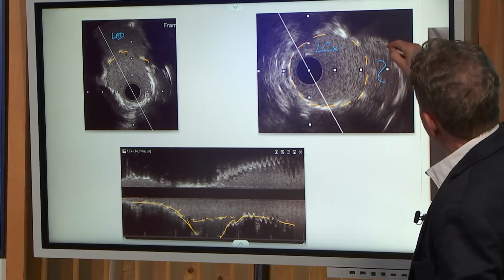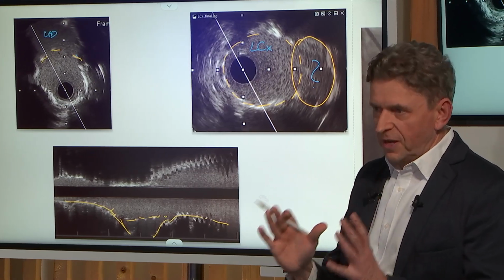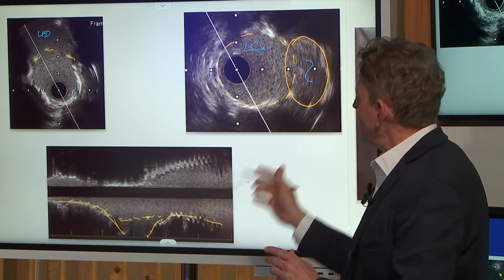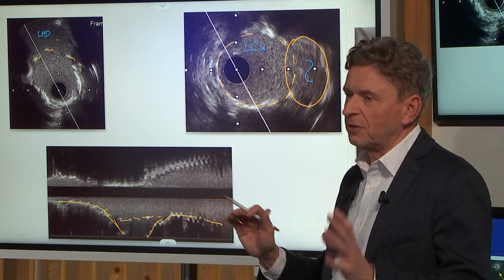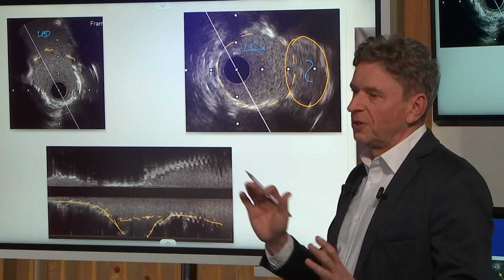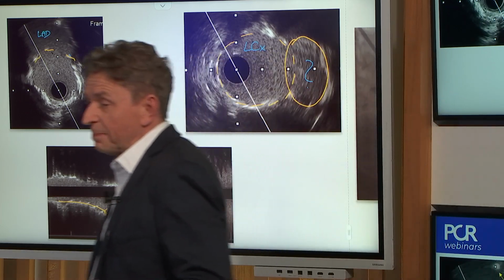And this is something that perhaps I think is the injury of the vessel with rota, done with the 1.5 burr in the initial attempt that couldn't get through. So this patient was very carefully observed after the procedure with a couple of echo scans, just transthoracic echo scans, just to be sure that there is no fluid or tamponade there. But fortunately, it didn't happen.